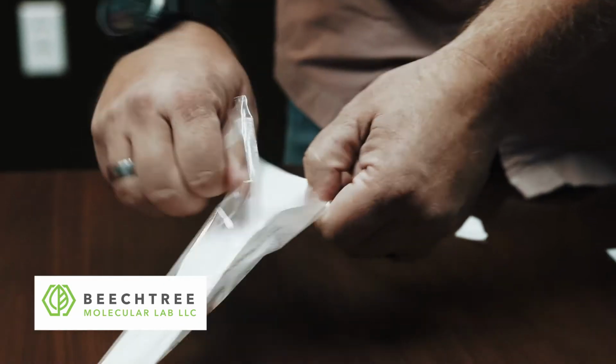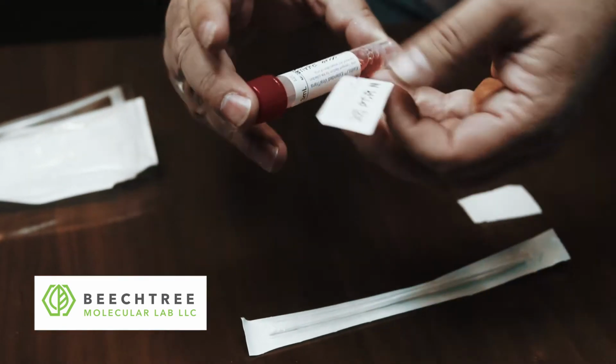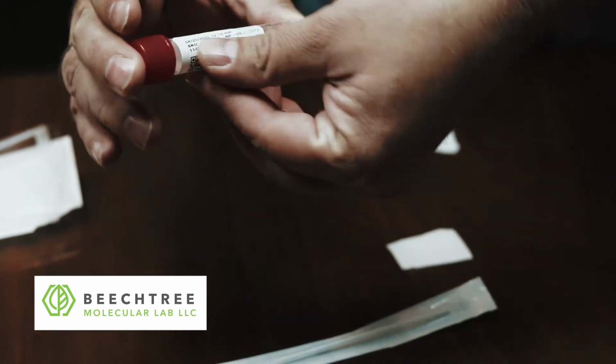Once you submit it, you will go ahead and either have them give the sample of the saliva, or you'll go ahead and swab their nose and get that sample from there. After you do that, you'll cap it, put the sample in your biohazard bag, and you can send it off to us.